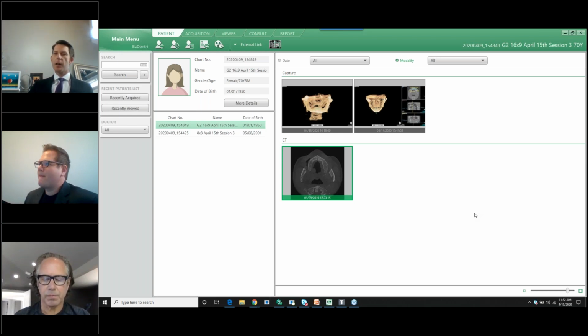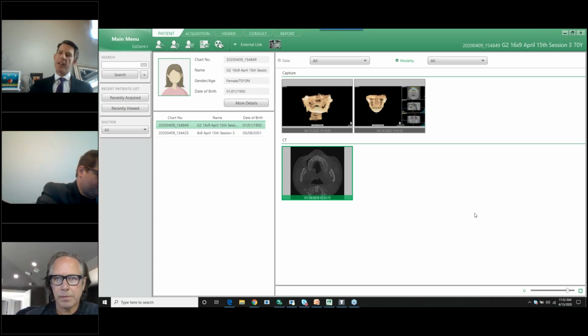One thing I really didn't talk about was exporting this and also working with guided surgery companies like 3D Diagnostics. So we had shared your information about your previous webinars.